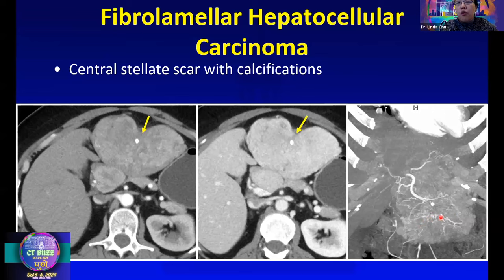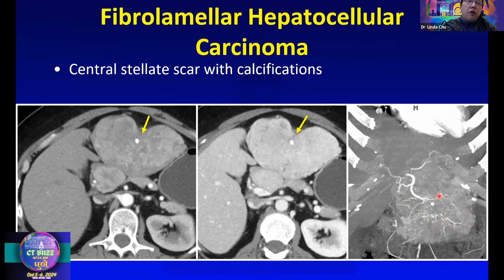When thinking about a lesion with a central scar, you may consider FNH, which also has a central scar. The key differential between fibrolamellar HCC and FNH is how heterogeneous the lesion is. If the feeding vessels look really irregular, you would be more worried about fibrolamellar HCC rather than FNH.